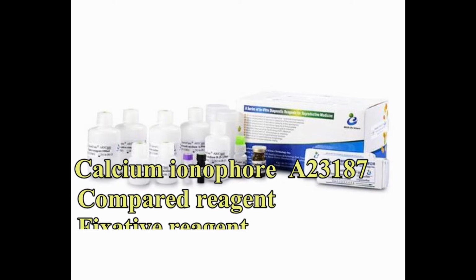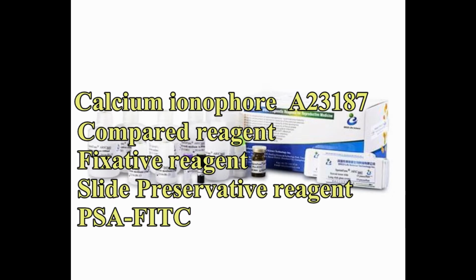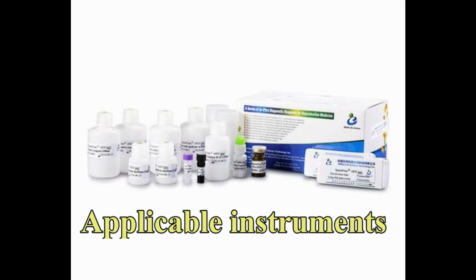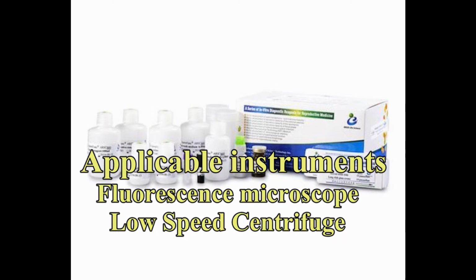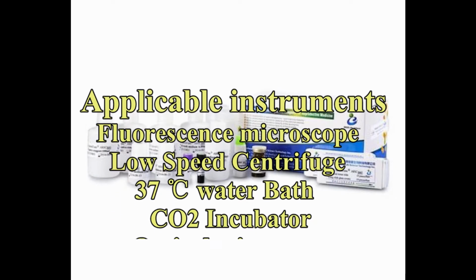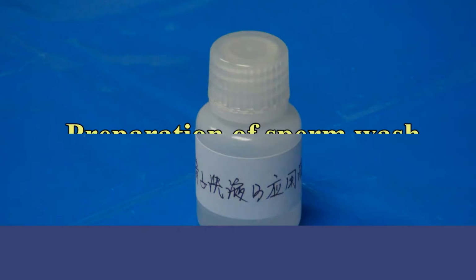Compared reagent: fixative reagent, slide preservative reagent, PSA, FITC, fluorescence solidified reagent. Applicable instruments: fluorescence microscope, low-speed centrifuge, 37 degrees Celsius water bath, carbon dioxide incubator, optical microscope, laminar flow cabinet.